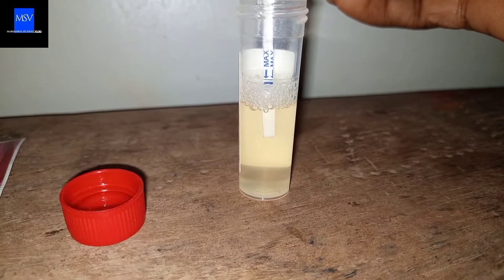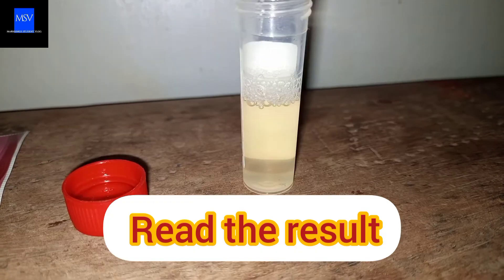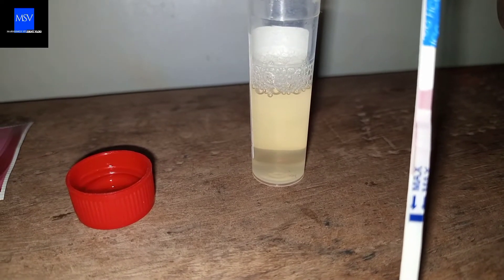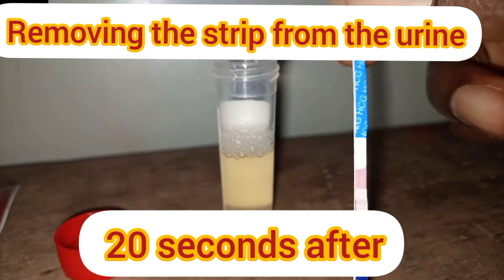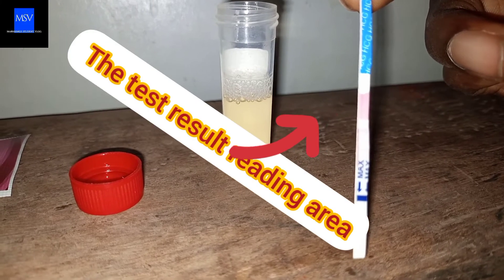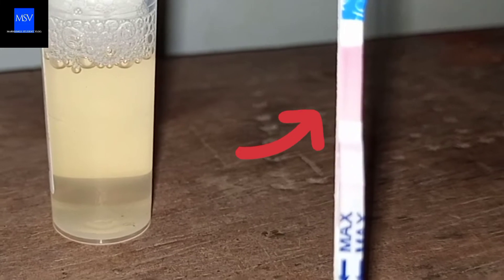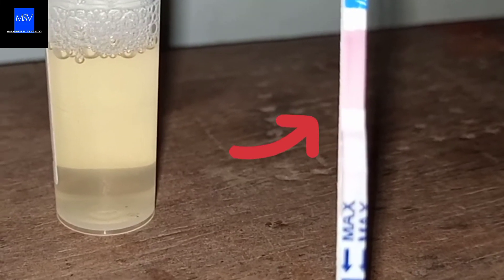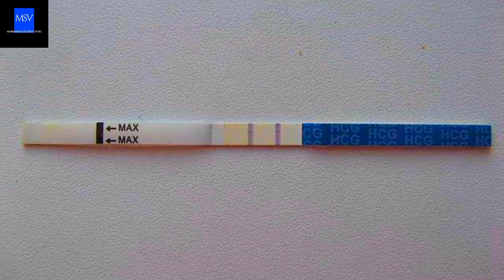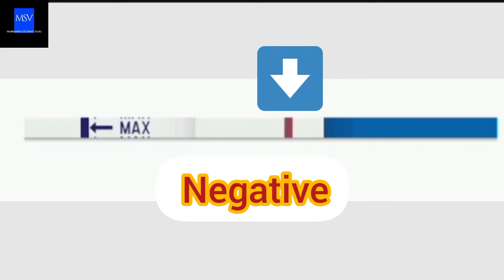After you've dipped it in the urine, leave it for at least 10 seconds before removing it and then read the result. The result should be read 20 seconds after removing the strip from the urine. You can say that the test is positive when two red lines appear on the result reading area of the strip. The test is negative when one red line appears at the top of the result reading area.